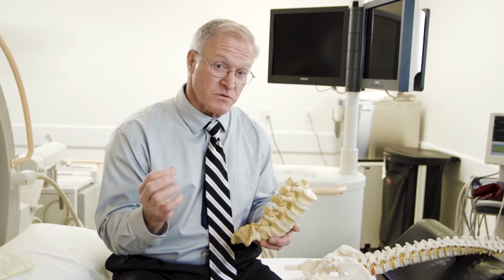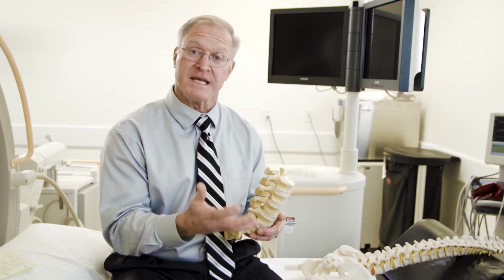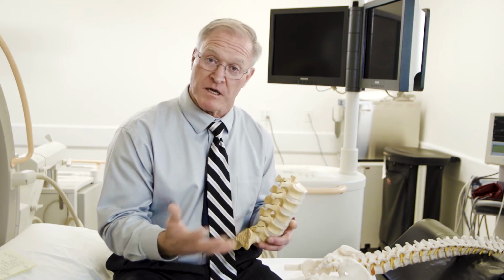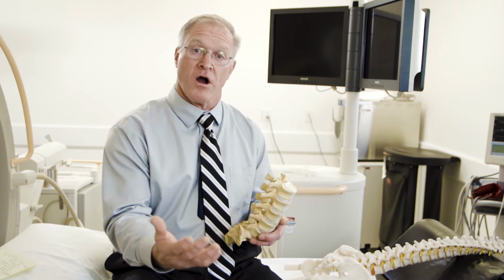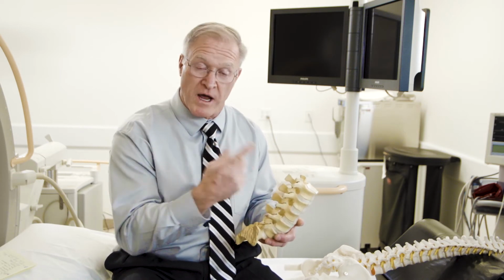Now, as anesthesiologists, we have other needles that are designed to go through that bag and place the medication inside that leathery bag, and that's a spinal block. You're not scheduled for a spinal block. Our medication will go outside that bag, simply in the space around that bag and surrounding the spinal cord inside the actual bony tube.